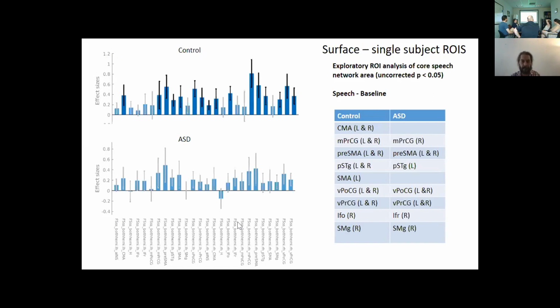So that's the name of my ROI file. Yeah. So I'm called ROI, and then it's first subject underscore Hemi. Yes. And so when I do a group, I didn't have one here, but when I do a group, you essentially put that whole thing in there. And that's so that you can do multiple separate ROI analysis, and then one layer. Yeah, but it doesn't say any script here.